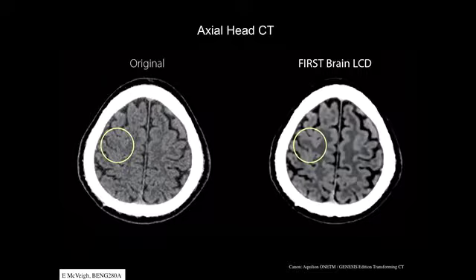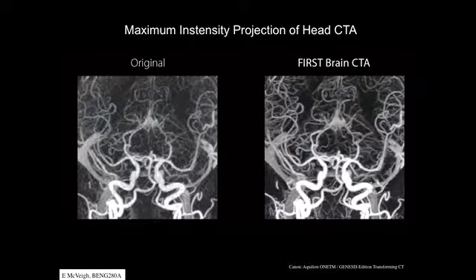of the X-ray beam. So here's an example of three-dimensional data taken in a patient's brain after the injection of a contrast agent. And so you can see that there's very bright signal in the vessels in the brain. So these are the vertebral arteries coming up here, and very small vessels are well visualized when that contrast agent is in the brain. And so if you want to find something like an aneurysm, this is a very sensitive way to do so. You would like high resolution to make this picture, right? You want to see very small vessels.